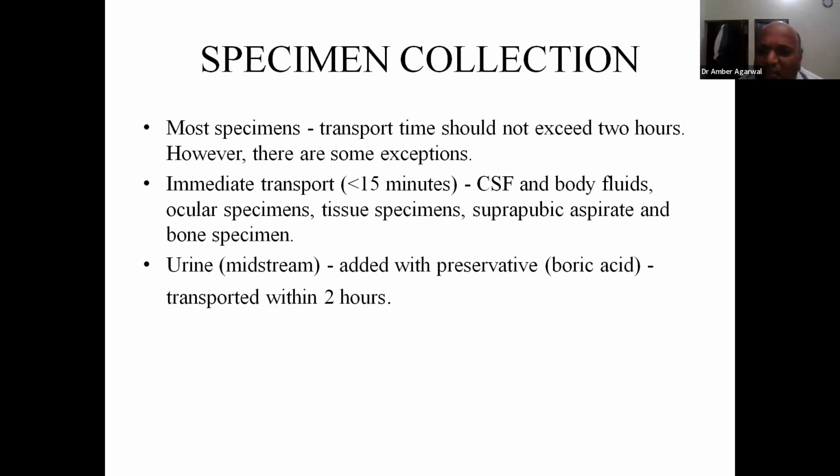Again, for urine, urine in itself is a media for growth. If a person has given his or her urine, then as in females, the urine does not pass through a clean site, it gets contaminated with the flora, and that flora grows, and that is sometimes reported. So for that, you can send the sample in boric acid. What boric acid does is it stops the multiplication of the bacteria present.